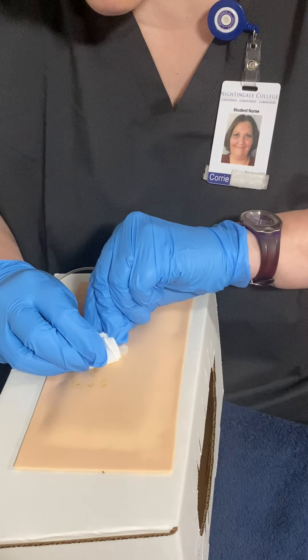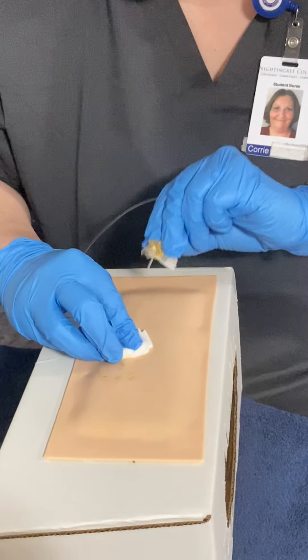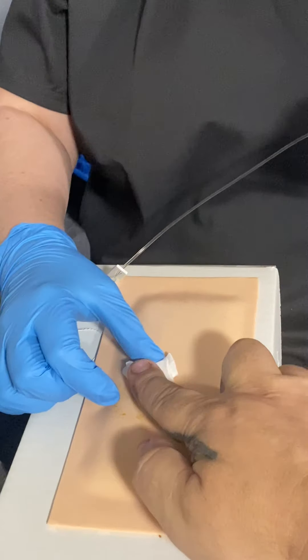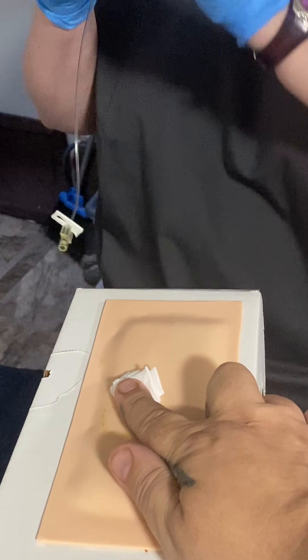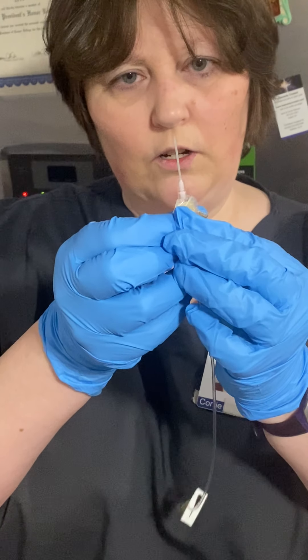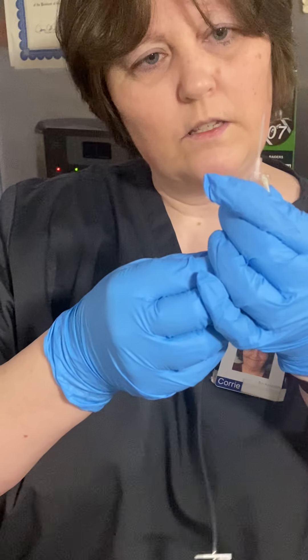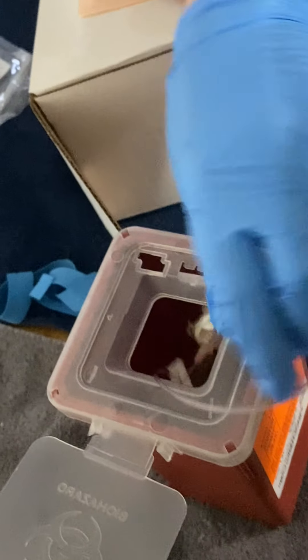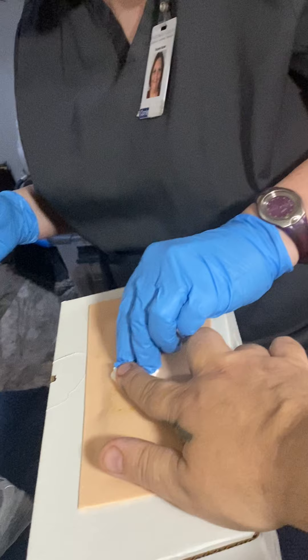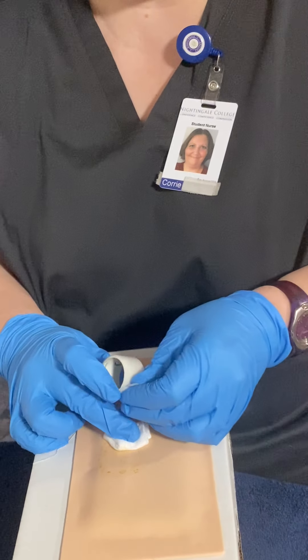All right, here we go — one, two, three. Okay, you got it? Yep. Now I'm looking at this IV — it's a 20 gauge and the catheter that's in here is nice and intact, it's the one-inch that I put in, so everything looks good. I'm going to put that into my sharps container. Let me take a look here — you got it? I got it. I'm going to go ahead and put some tape on here.